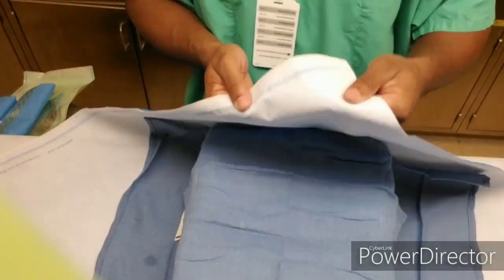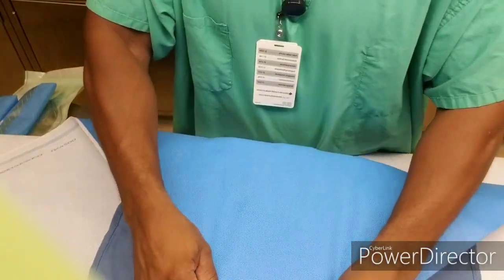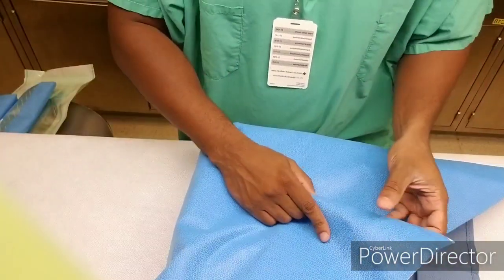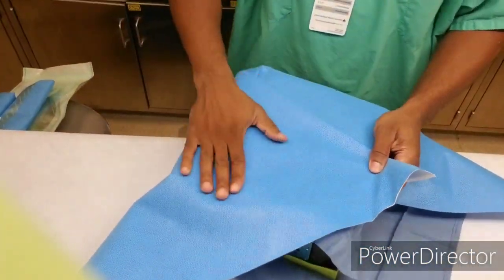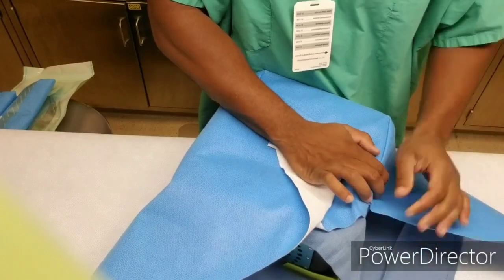The video I'm touching on is basically a simple way of wrapping — it's the envelope wrapping. There's a whole bunch of other ways, but this is the most basic way that is done in sterile processing. Like they say, there's many ways to skin a cat, and it goes the same with wrapping. There's many ways to wrap.